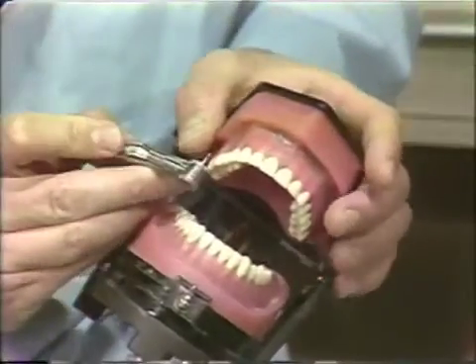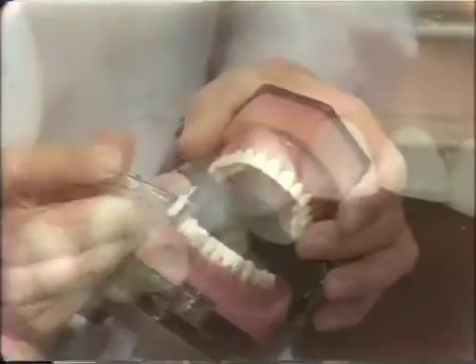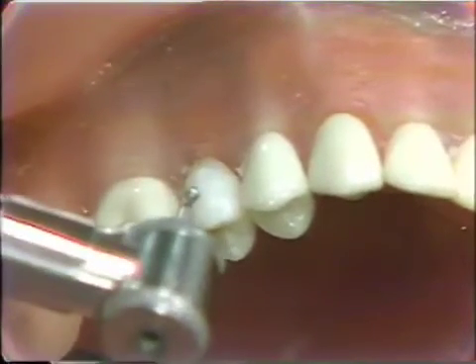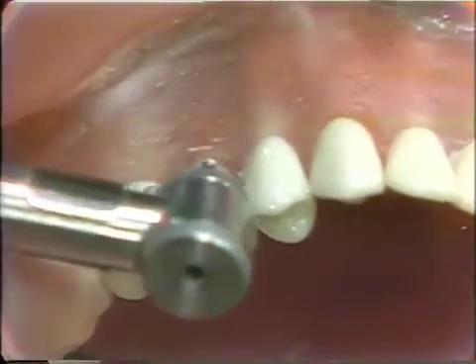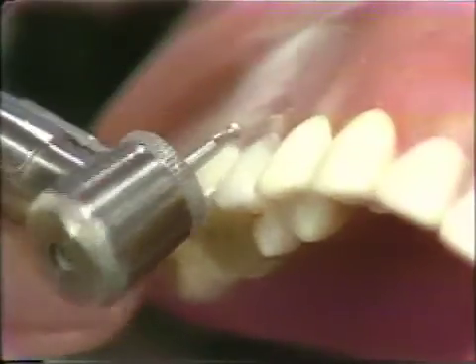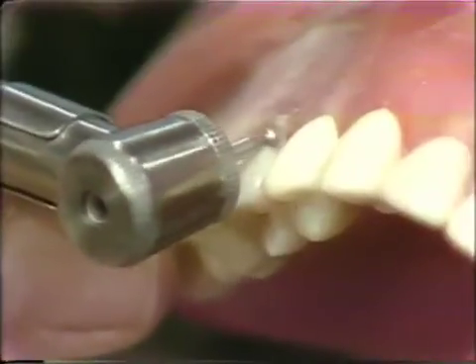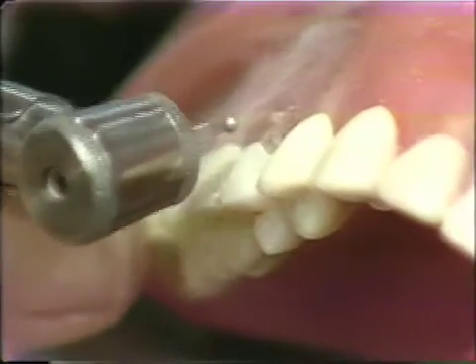It's very important that we reduce this labial surface enough in order to get good contour and to get natural color. In this typodon situation, we will keep the finishing line above the gingiva. With this technique, we will bury this diamond to the shank.